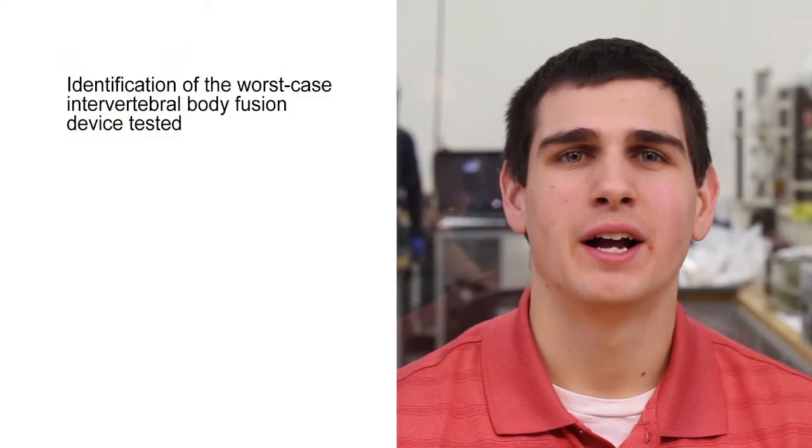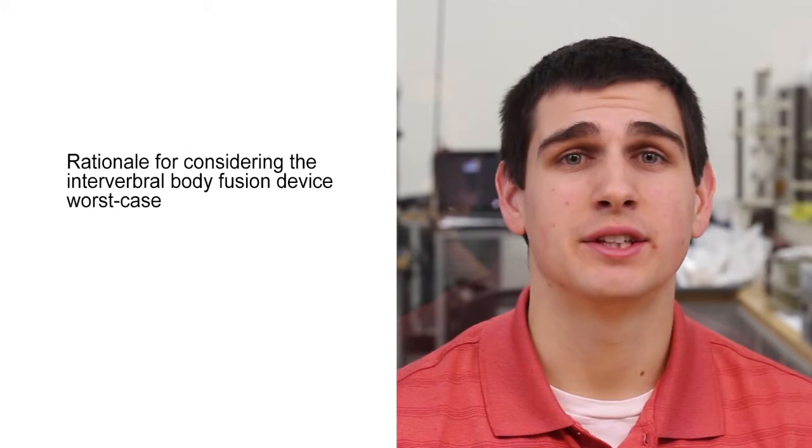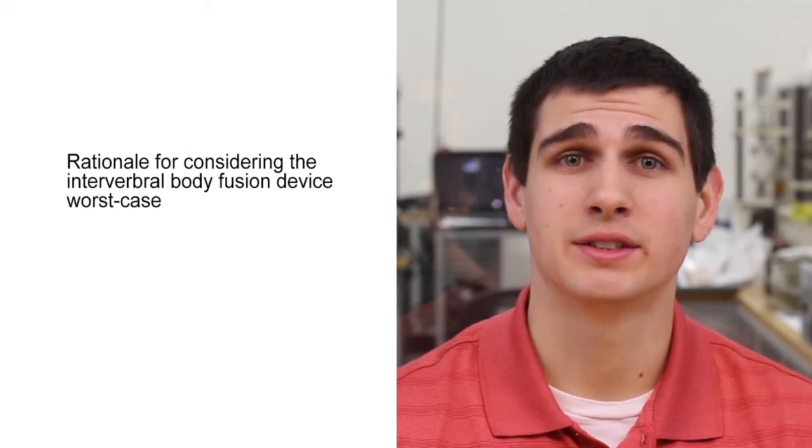It is also recommended that additional testing be performed depending on the specific design, material, and/or method of attachment for a given intervertebral body fusion device. One such test is expulsion, which is a test to investigate the forces required to dislodge the implant from the intervertebral space. The FDA recommends the following: identification of a worst-case device and rationale for choosing that device.